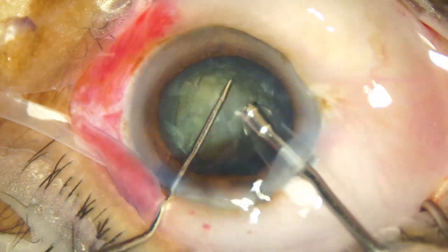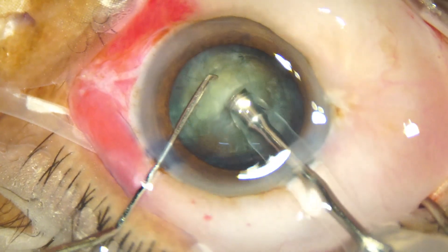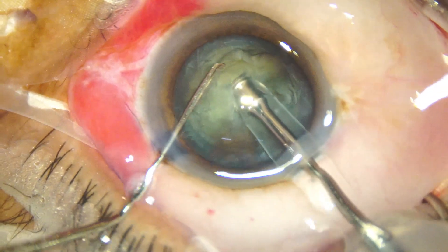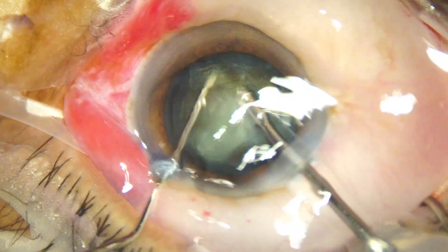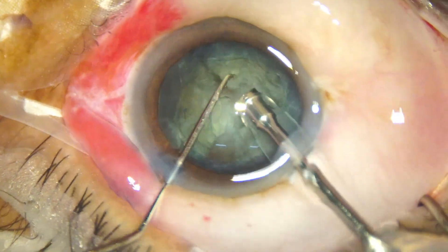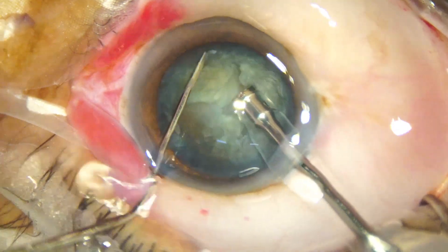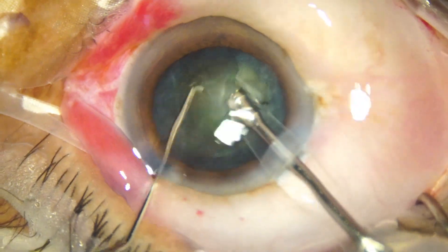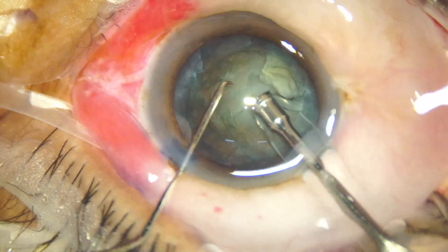She turns the nucleus, holds about 60 degrees away, and at this time the chopper was in a nice position and she has got a very good crack. She then turns the nucleus and holds it.